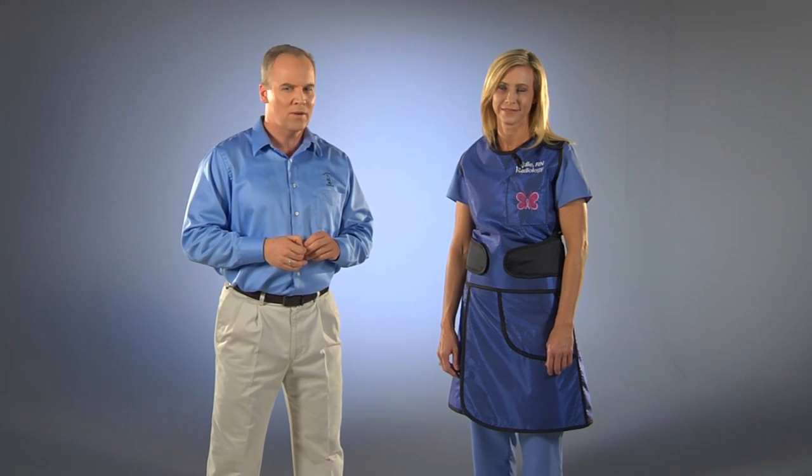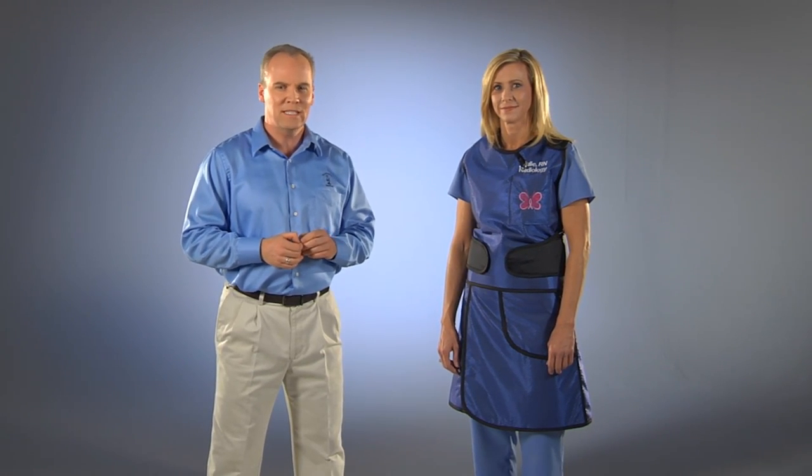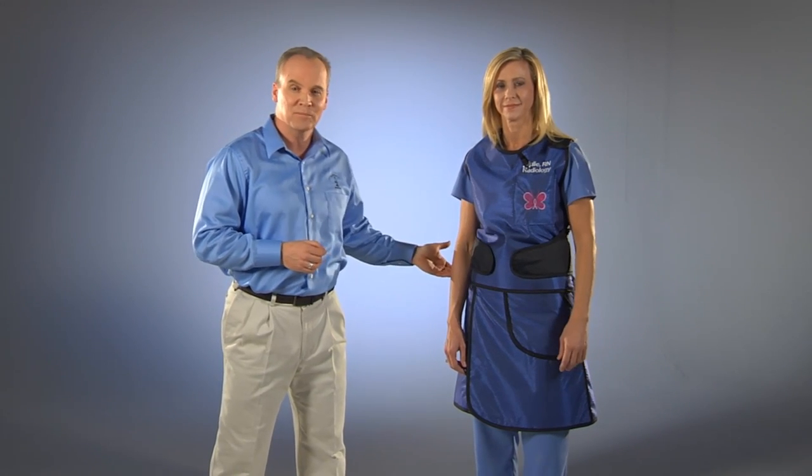The Peak Vest and Kilt provides front and back protection in a two-piece apron. The Peak Vest offers excellent comfort and support for those who need to wear their aprons for long periods of time. The reason for this is that the Peak Vest is designed to relieve weight from the shoulders and redistribute the weight on the hips.